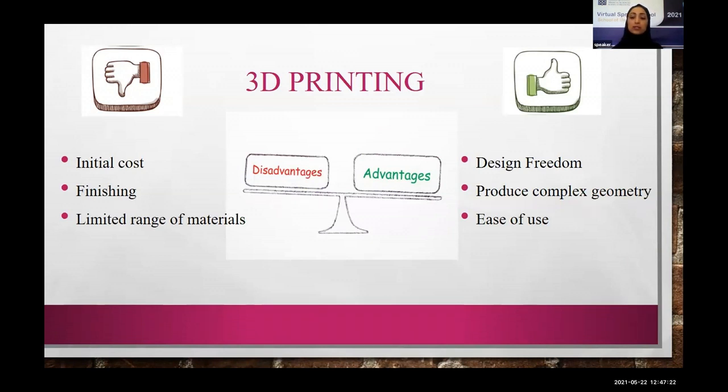Design freedom is considered one of its main advantages. It means that it is virtually unlimited what can be designed, including hollow devices, which is impossible by subtractive manufacturing technology. The other is producing complex designs. A complex design by 3D printing can be fabricated in just one fabrication cycle, unlike subtractive manufacturing technology, in which different parts would need to be fabricated and then assembled.